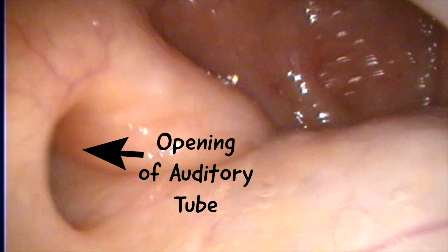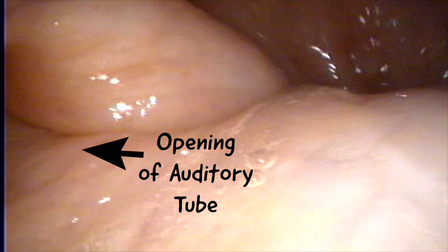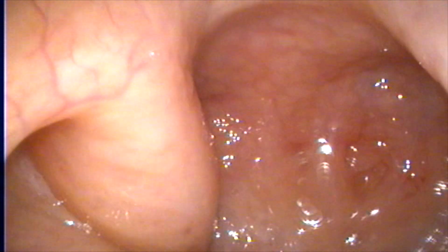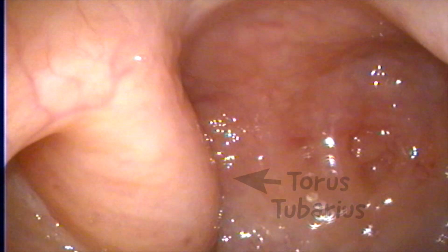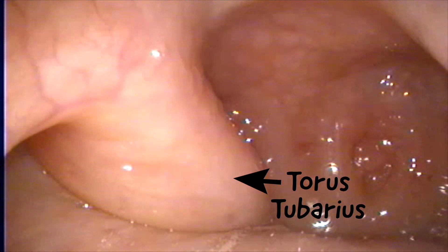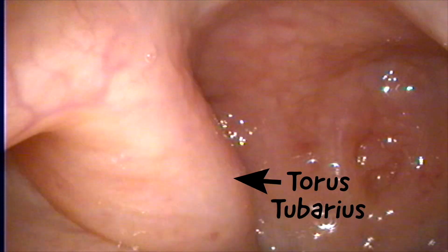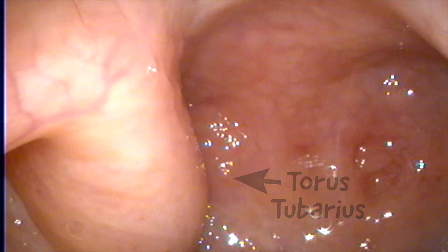We are now approaching the opening of the auditory tube on the lateral wall. This is also known as the eustachian tube, and just posterior to this is the torus tubarius, which is known as the cushion of the auditory canal. It is a mucosal elevation in the lateral aspect of the nasopharynx.